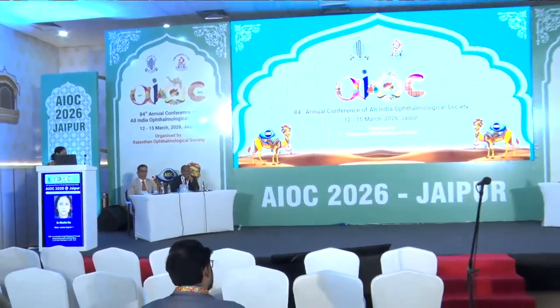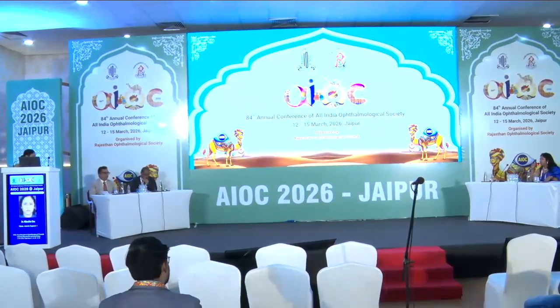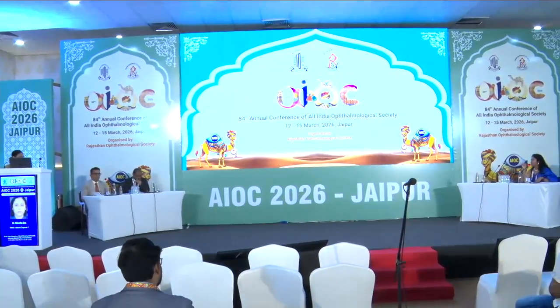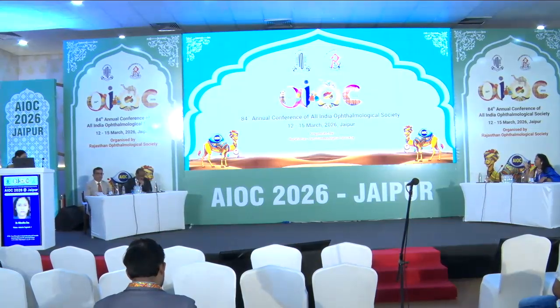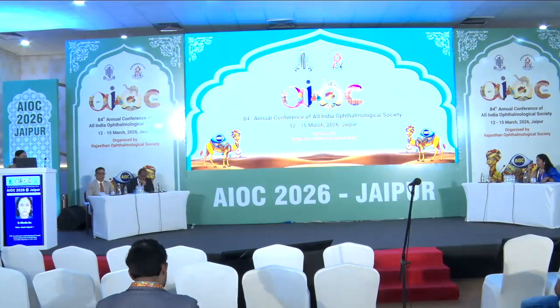Thank you very much. Beautifully presented, Dr. Nivedita. Just one point. Usually when we talk about cutting the IOL, we do it in the center, in the optic. You cut it at the haptic because I know it got entangled in the iris. Yeah, it got entangled. That's a good thing. But I think it would have been better if you had included in the video that you had taken out that haptic. You were concentrated more on taking out the optic, that you forgot to show us that the haptic was still there. So you need to remove that. Otherwise, it was a nice presentation.